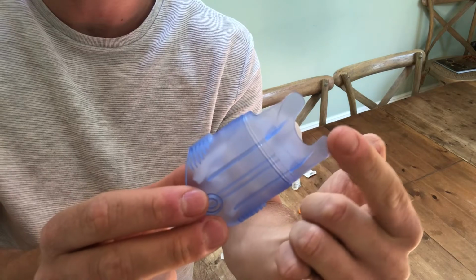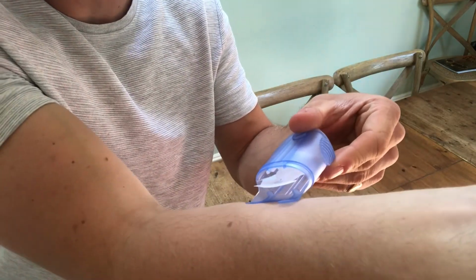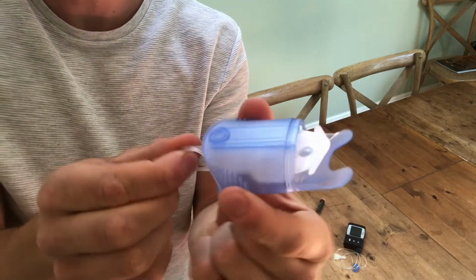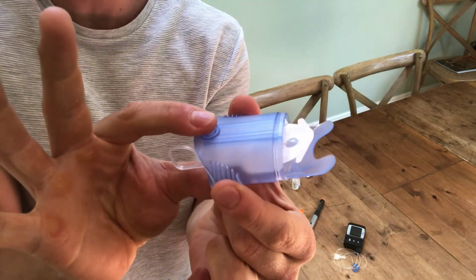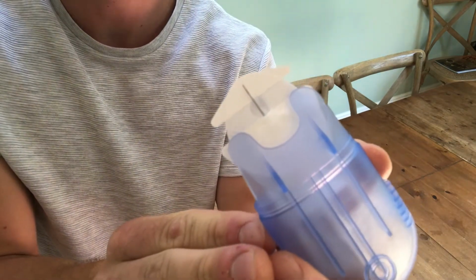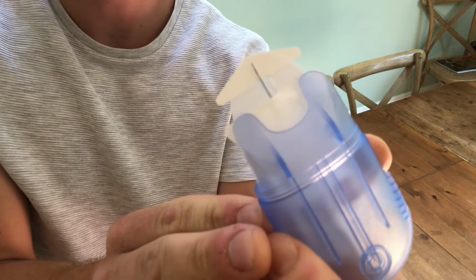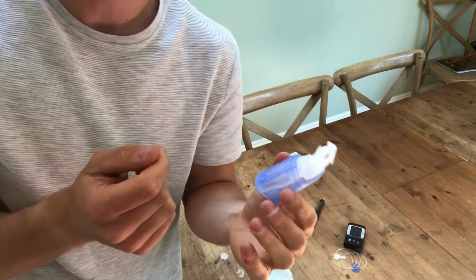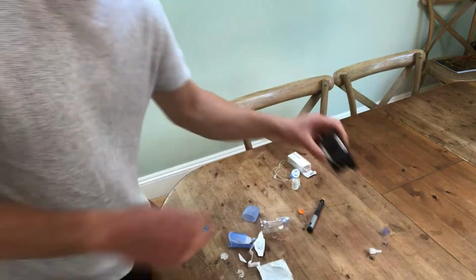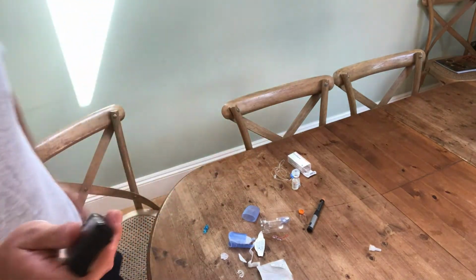Okay, so these blue pads here need to run flush, like so, with the skin. You pull this back, you squeeze when it's flush on the skin, and it shoots out the needle. It's really not that bad. Shoots out the needle, you don't really feel it. Shoots out the needle and brings out the needle and leaves a tube inside. I'm now ready to put this into the side, and I'm good to go.